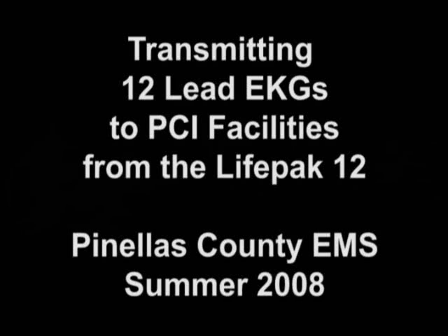Okay gang, listen up. We wouldn't have thrown this video together if it wasn't important. We have a short video to show you how we're going to be transmitting 12 lead EKGs. So, give us 9 minutes of attention and you're going to learn something that may enhance our patient care.